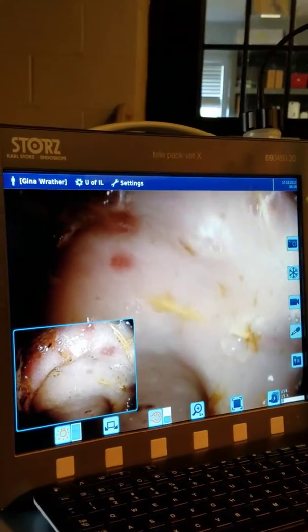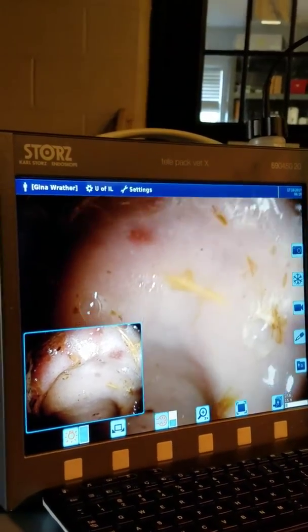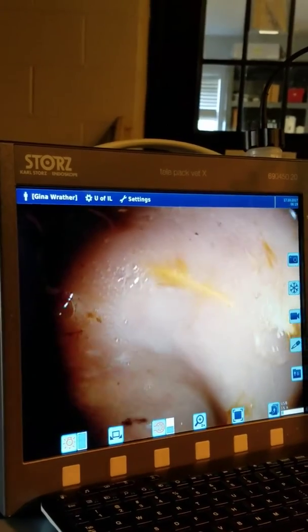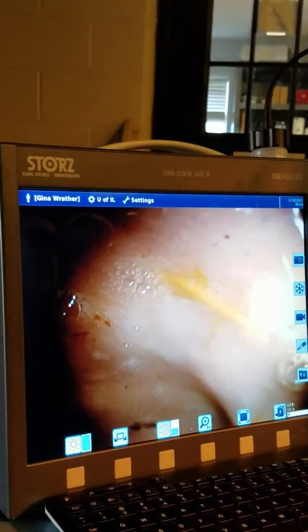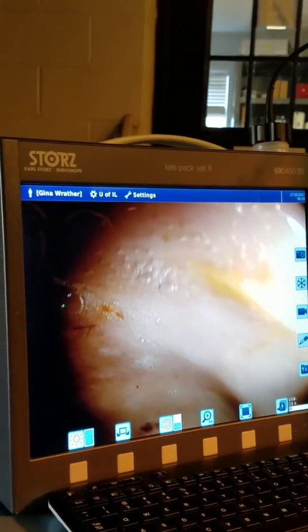Just some bruising down here — a tiny bit, just kind of under it.